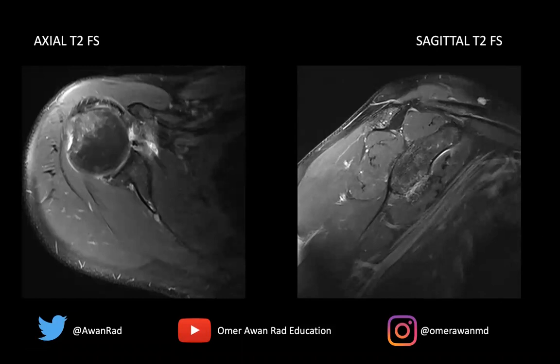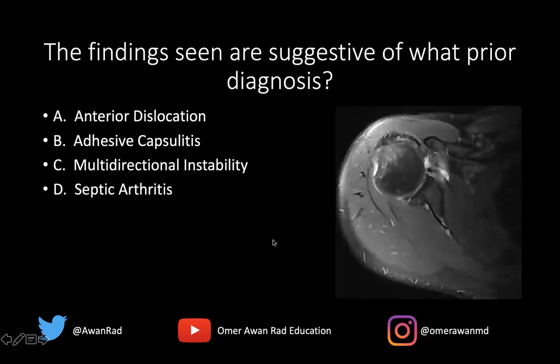Hello everyone, and welcome to MSK Unknown Case Series, case number 44. Here we have an axial T2 fat sat image through the shoulder and a sagittal T2 fat sat image through the shoulder showing some abnormalities that you should pay attention to. The question is: the findings seen are suggestive of what prior diagnosis — an anterior dislocation, adhesive capsulitis, multidirectional instability, or septic arthritis?